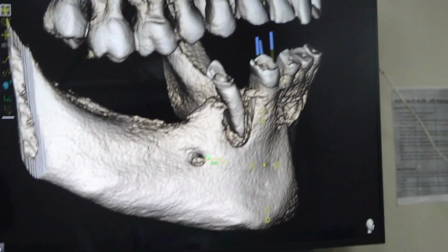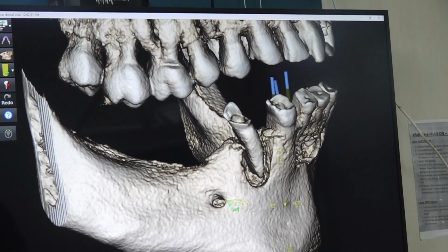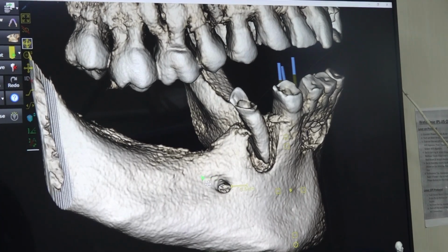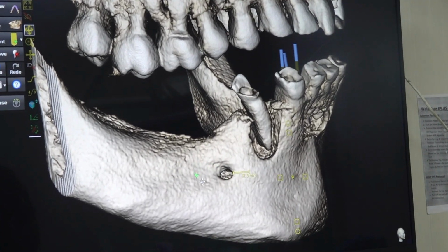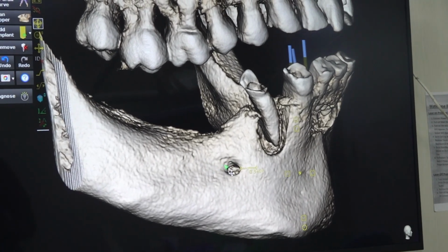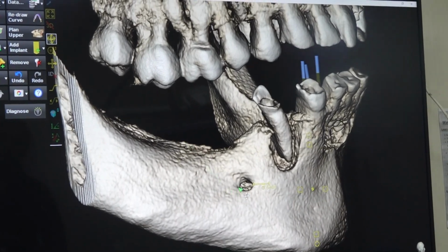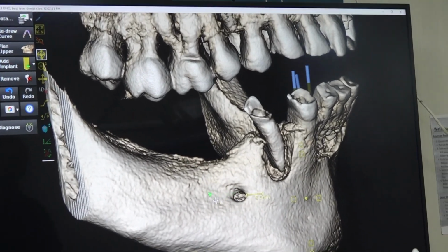So we are curetting the mental nerve from the mental foramen. If you cut a 5 mm block of bone here, there will be empty space, so the entire nerve will come distally. So how thick is this bone?